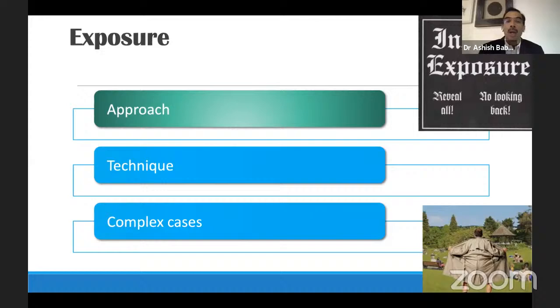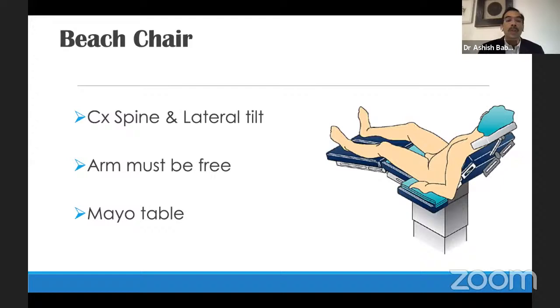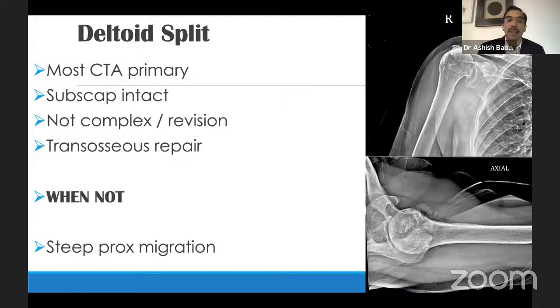I think it's a given that all of us would resort to a beach chair position, a lazy beach chair, deck chair position. It's important to stabilize the cervical spine. I spend a lot of time doing that. And there's a lateral tilt added. I'll talk about that later when we come to the glenoid exposure. It's very important that the arm must be completely free so that you can bring it back in extension when you want to ream the humerus. And so the table should not be a constraint to exposing the proximal humerus. And I almost always use the Mayo table as my first trusted assistant.